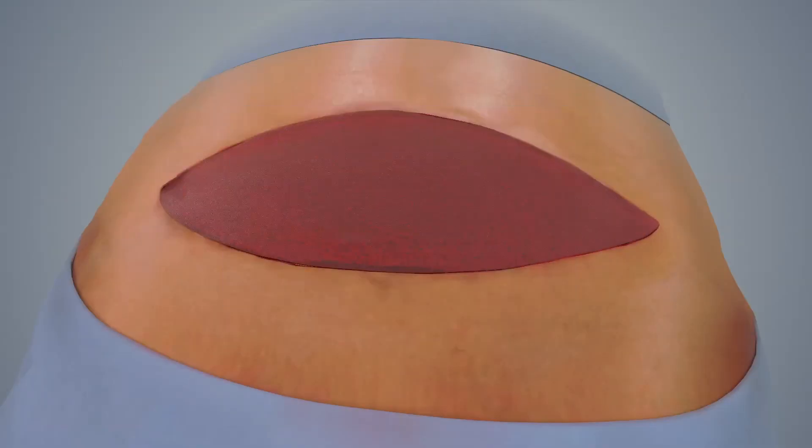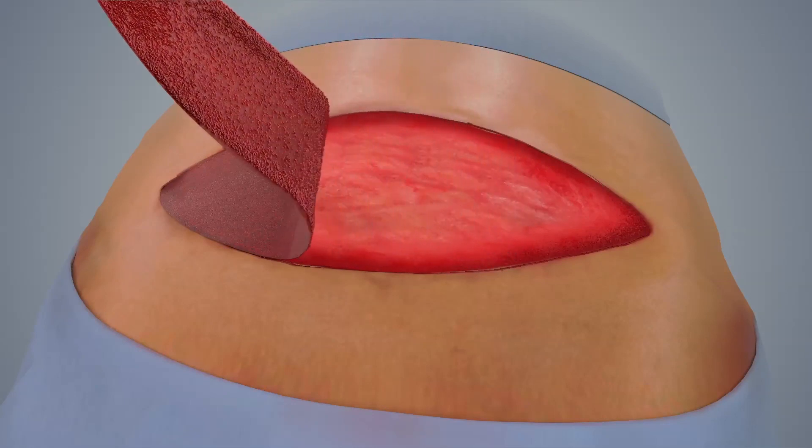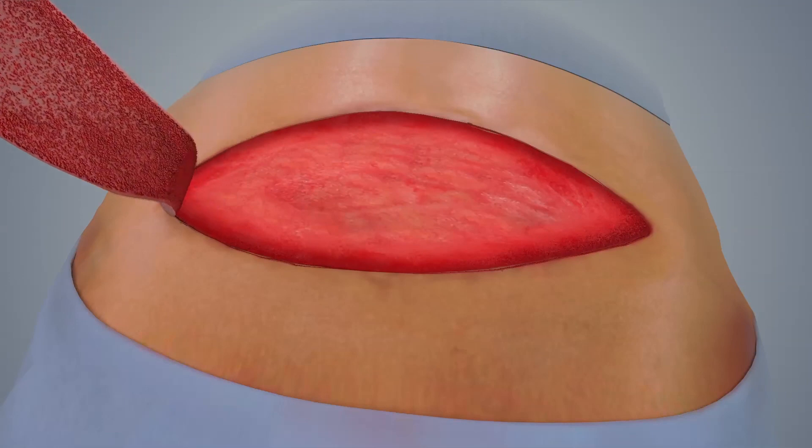Once the neodermis has fully formed, a simple blanche test will indicate that the BTM is ready for delamination. The sealing membrane can be removed. The new dermis is ready for closure according to the clinical choice of the surgeon.